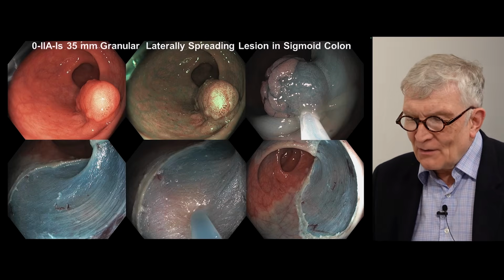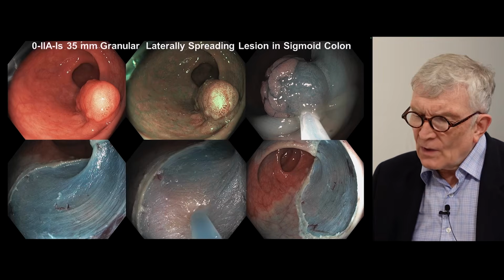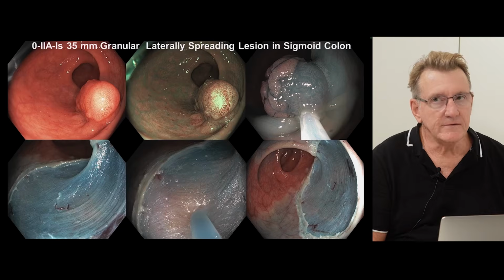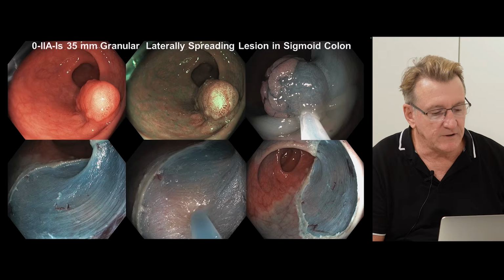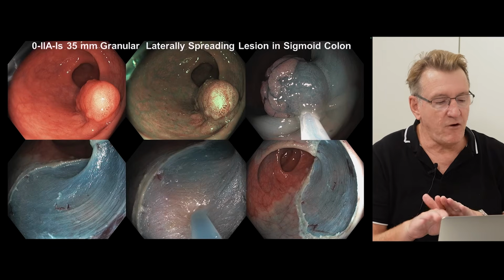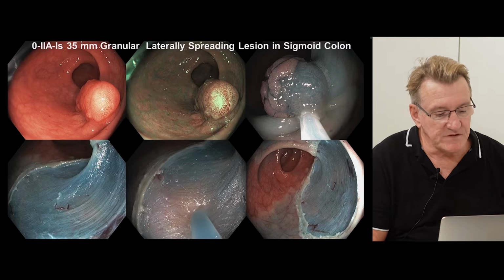So tell me about if muscular tissue is visible. Is that one thing you also mentioned? You re-inject. Yeah. With the needle in, right? With the needle retracted. Yes. So here, if we look at this picture again, you'll see down the bottom the parallel fibres, the white or grey fibres of the muscle layer. They're parallel to one another. They're obviously different to the bland blue mat of the submucosa, and they're not avid for the dye. So this is exposed muscle.